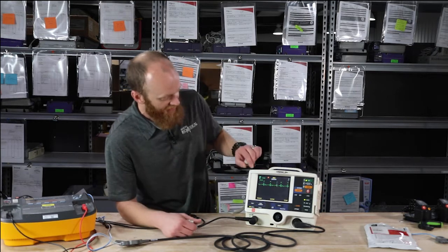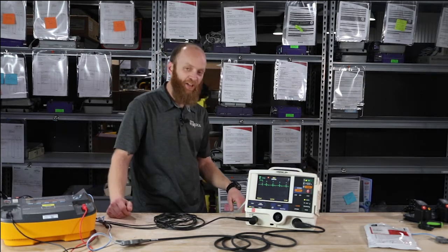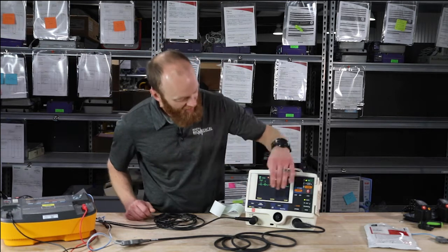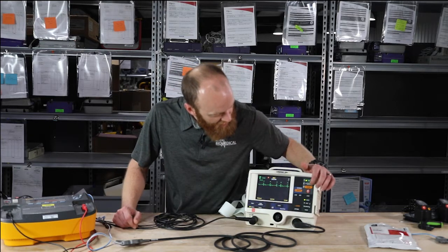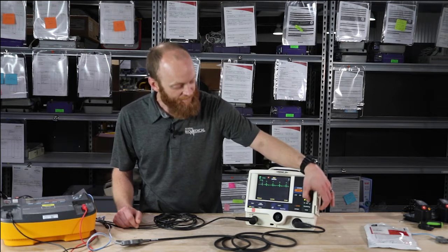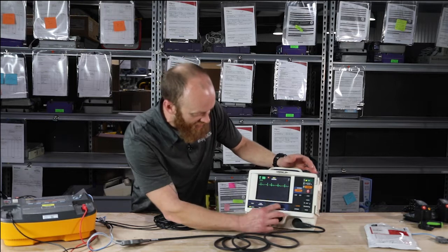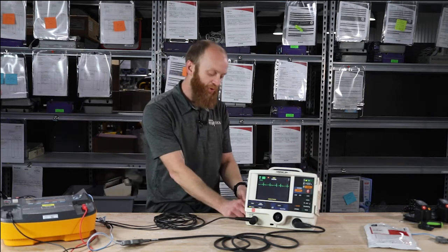To go over the rest of the buttons: we have our code summary button — once pressed, it prints out the entire case from the time you powered it on. Every keystroke is saved and documented, time and date stamped. The home button brings you back into monitoring mode if you accidentally hit a button you didn't want. The event button brings up options — for example, if you want to document atropine or other medications during the case, you can hit event, select atropine, and it puts that into your trend report and code summary.